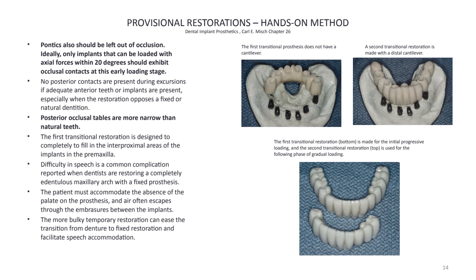They came and they're good candidates for having dental implants. The doctor inserts the implants, and then he or she modifies the denture to fit over the implant so the patient can use temporarily that existing denture as a temporary restoration.